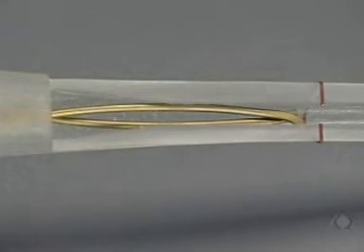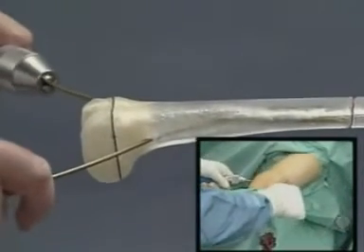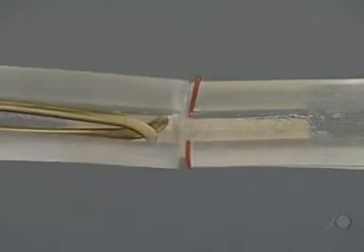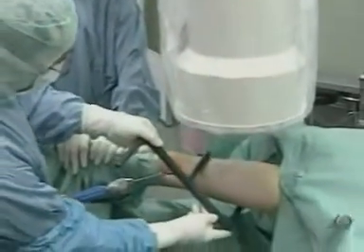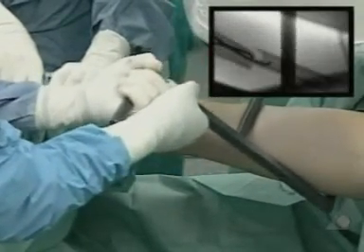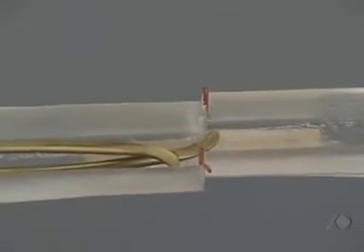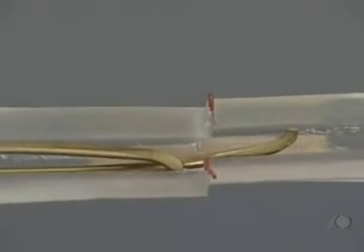If insufficient reduction is achieved, especially with transverse fractures, the distal fragment can be manipulated and accurately reduced with the help of the protruding nails using the so-called joystick technique. If this maneuver does not result in acceptable reduction, the small F-tool may be used. If reduction is still not sufficient to allow the nail to be advanced, a small incision must be made and open reduction performed. When the two medullary cavities are aligned correctly, the nails are advanced alternately across the fracture zone with gentle tapping or rotating movements until the main fragments are held securely, definitively reducing the fracture indirectly.